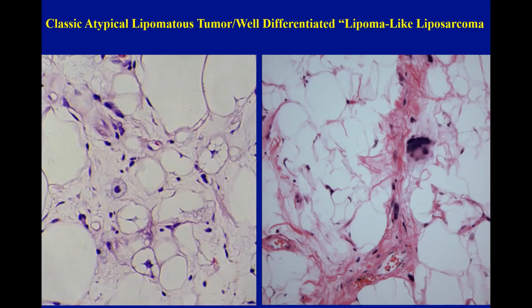If you're lucky, you may also see lipoblasts. And what are lipoblasts, really? Well, essentially, lipoblasts are these multivacuolated tumor cells here that show a scalloping or an indentation to a hyperchromatic nucleus. And you notice they're very variable. You don't see the uniform vacuolation or granularity that you typically expect in a hibernoma, but instead, variably sized vacuoles, the nucleus is often not centrally located, but paracentrally located. And this is a classic lipoblast.